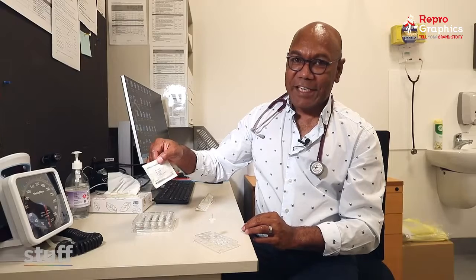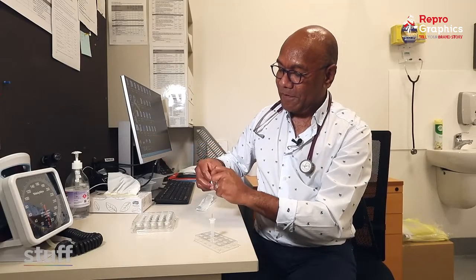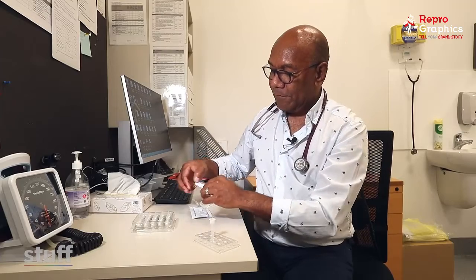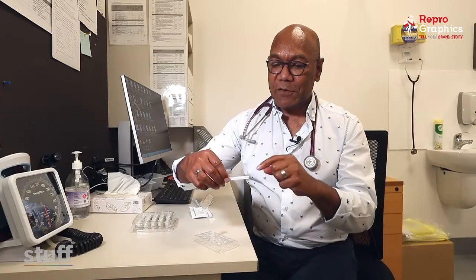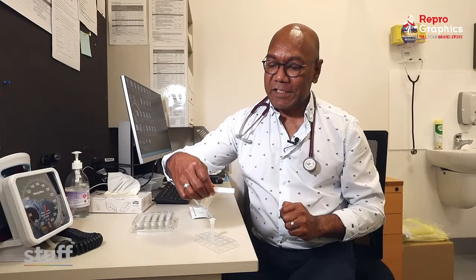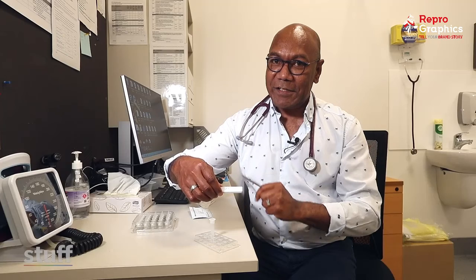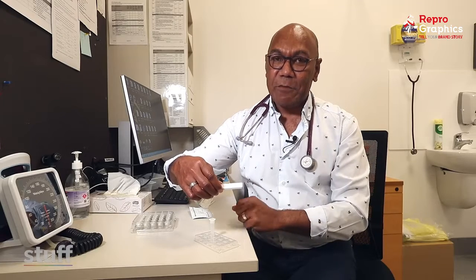You then have the testing kit, which you open up — and that's what it looks like. It's got a well at one end, and this is where it'll tell you whether the result is positive or negative. If it's C, that's the control — that's a negative test. If you have two lines with C and T, that means you've got a positive test.